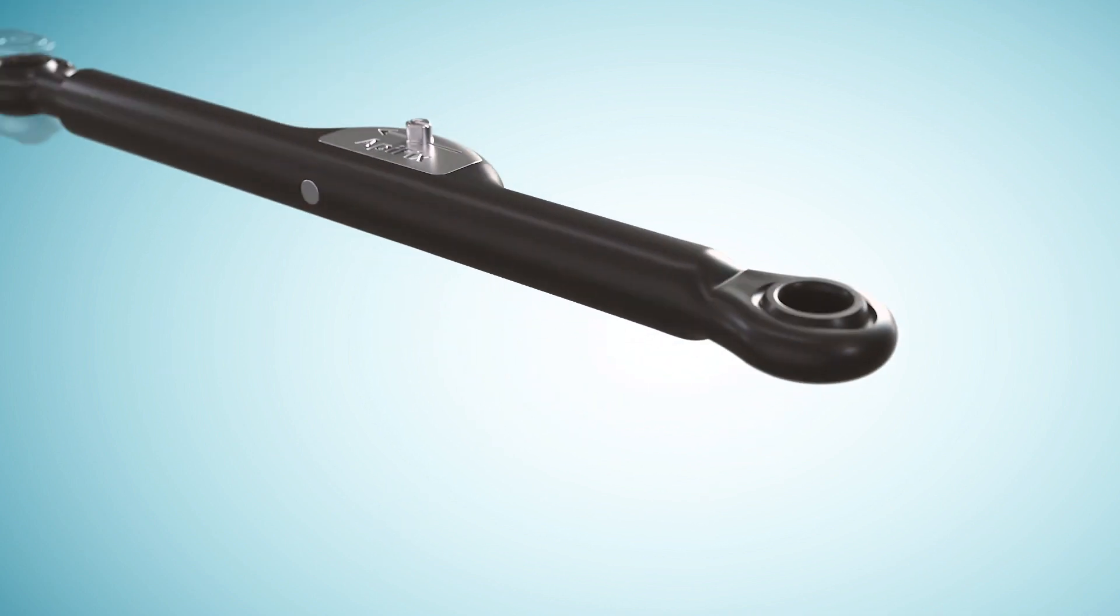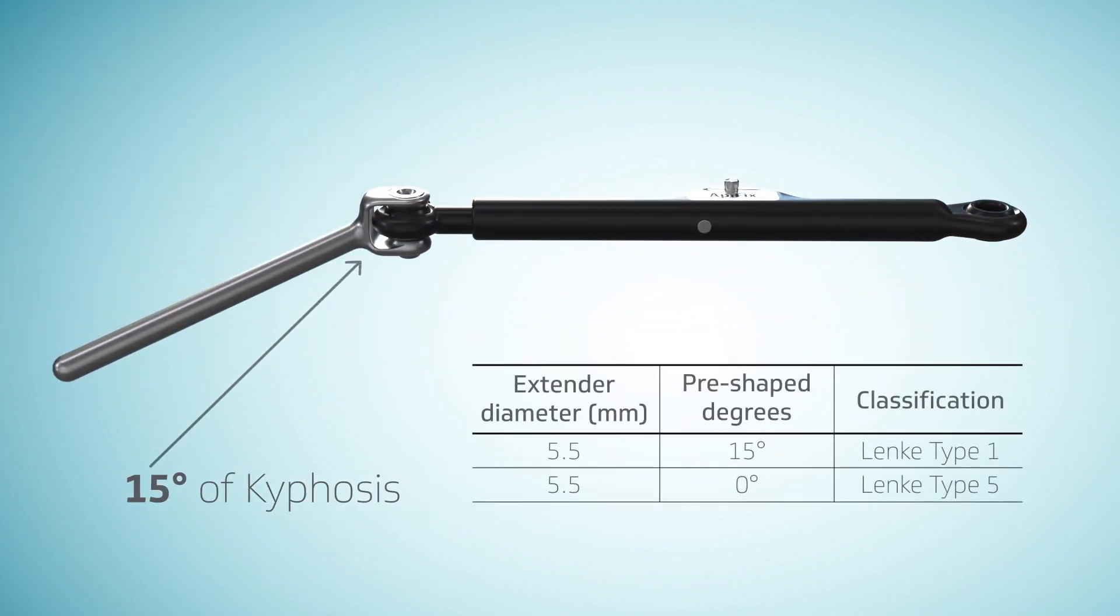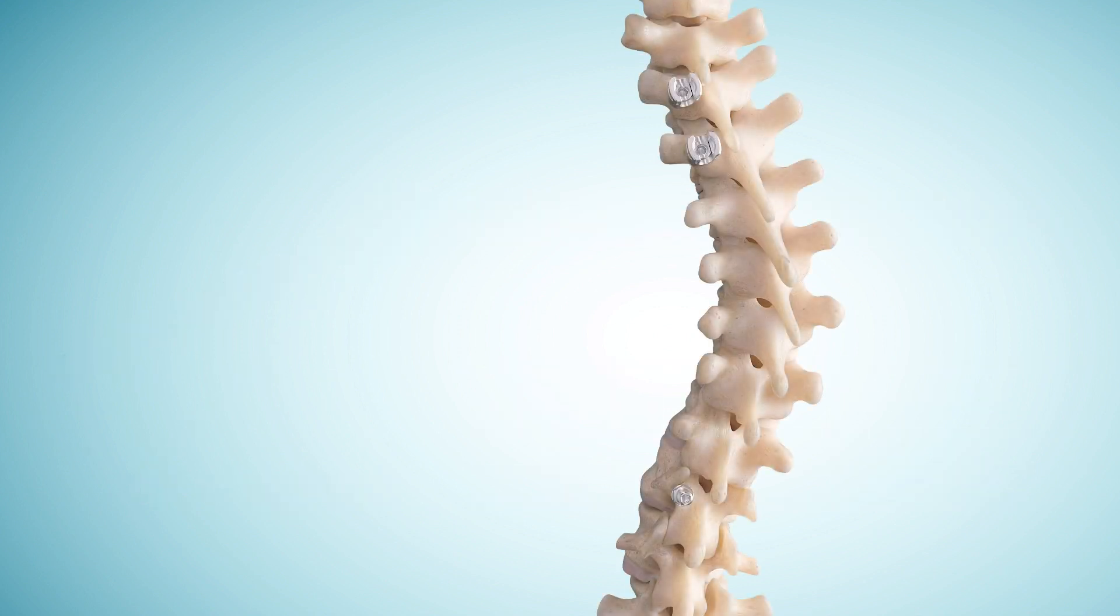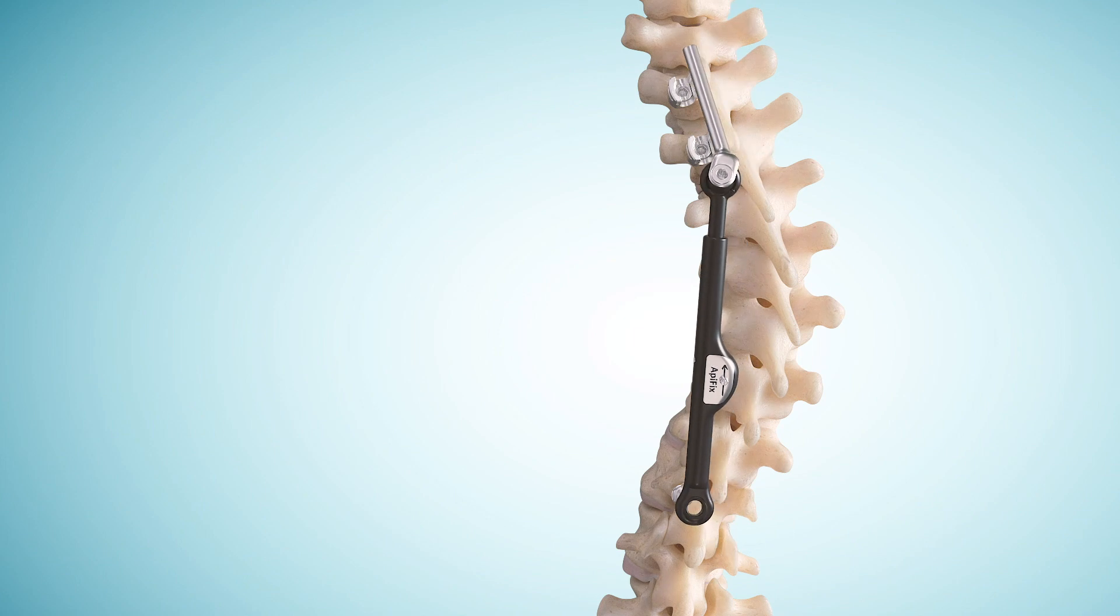The LENKE-1 extender is pre-shaped with 15 degrees of kyphosis for sagittal alignment. The system is inserted onto the three pedicle screws and final tightening is completed.